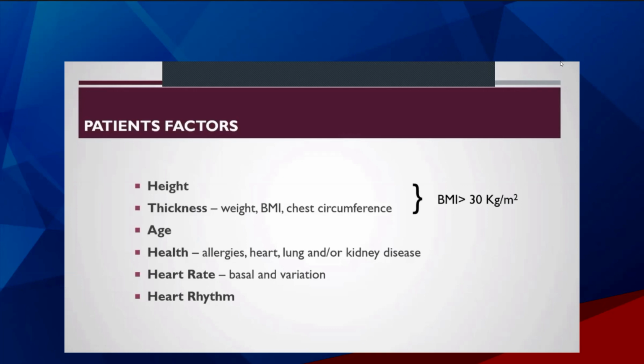Heart rate, baseline and variation, and the presence of arrhythmias are also significant variables to take into consideration with imaging the heart.